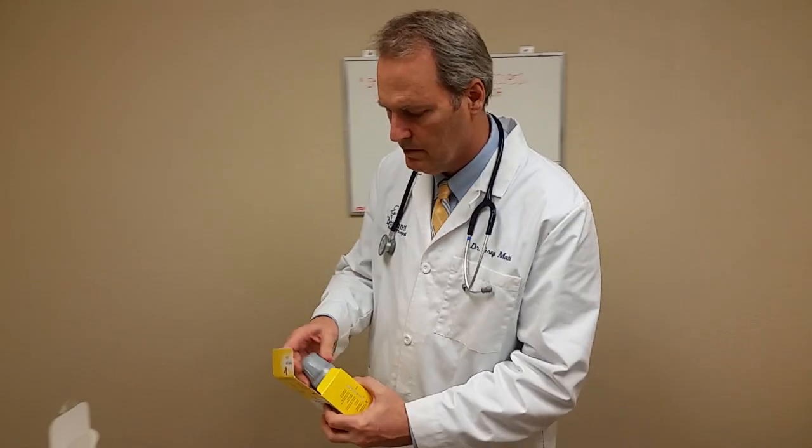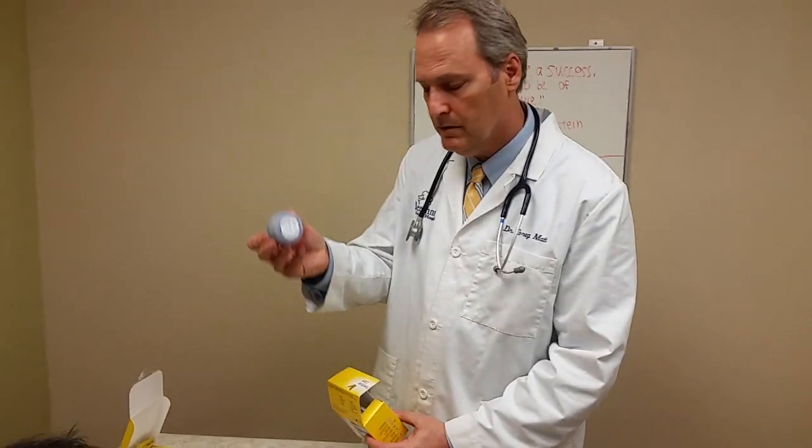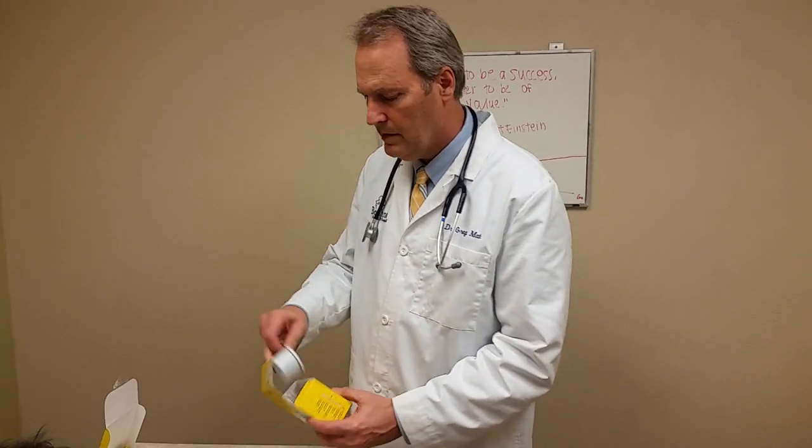I'm going to demonstrate how to install the FreeStyle Libre sensor. You open up the package and you're going to get an applicator and the disc itself.